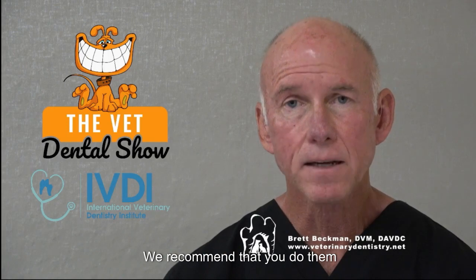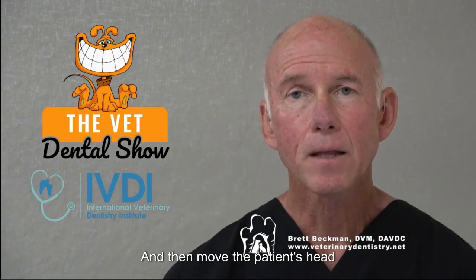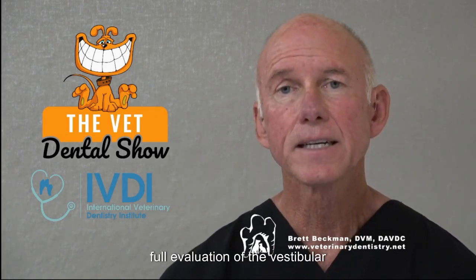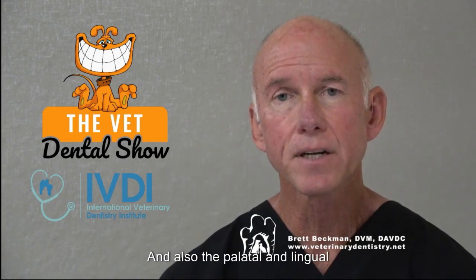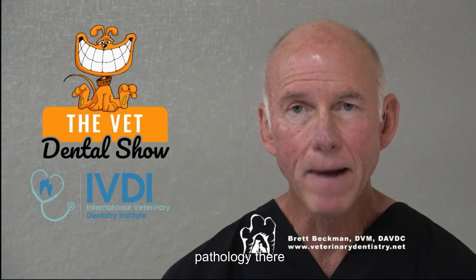We recommend that you do them with one side up in lateral recumbency initially, and then move the patient's head to the other side, do the other side in lateral recumbency, and then you've got your full evaluation of the vestibular and also the palatal and lingual aspects of those teeth on that chart. You can call the client back, let them know that there's additional pathology there.